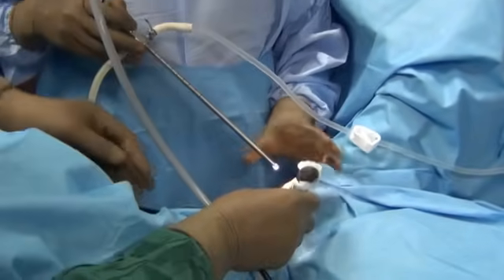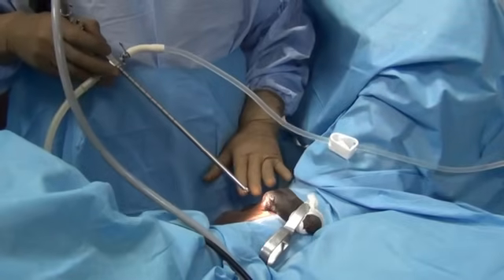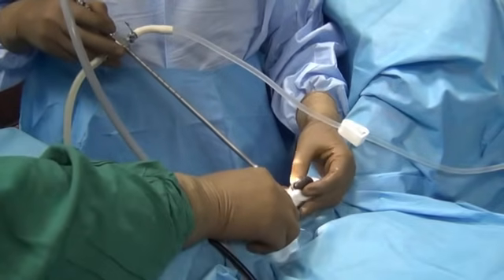Now we have spent about a good 7 minutes, and the Lignocaine jelly that was instilled has stayed inside. By this time, I am sure the urethral passage is nicely anesthetized. We will now introduce the cystoscope sheath into the urethra.